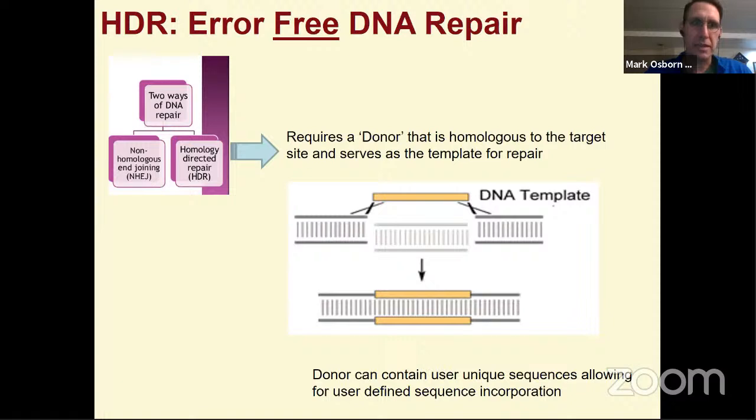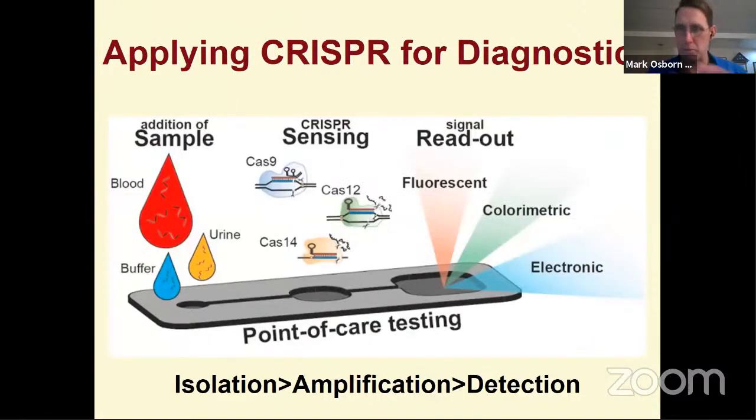We're also very interested in the DNA base editing technology, but I'm not going to speak about those repair strategies today. I'm going to focus more on our efforts for diagnostics using DNA binding. That's really the key component, being able to use a programmable reagent that allows us to interrogate and bind a user-defined sequence in the context of disease.